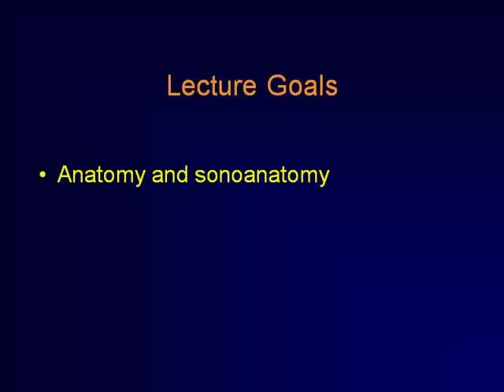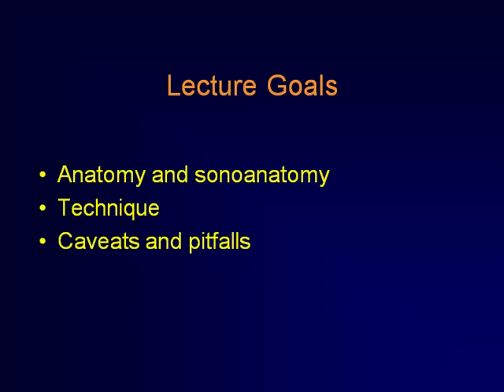The goals of the lecture are going to be to understand the anatomy and sonoanatomy of the pleura, to understand the technique of how pleural evaluation is done, think about some of the caveats and pitfalls of the exam, and we'll look briefly at the science behind this as well.